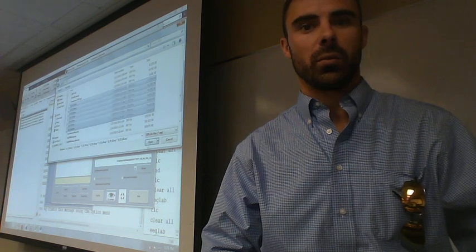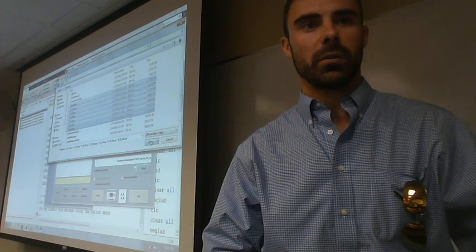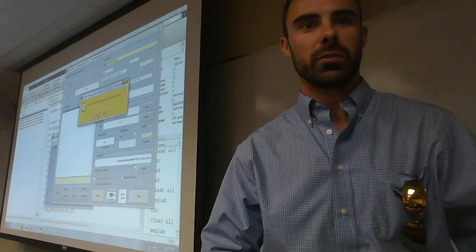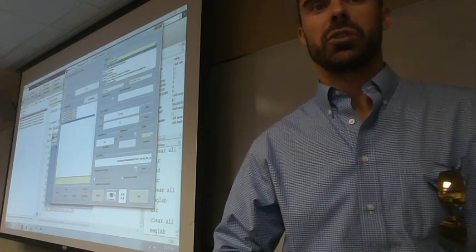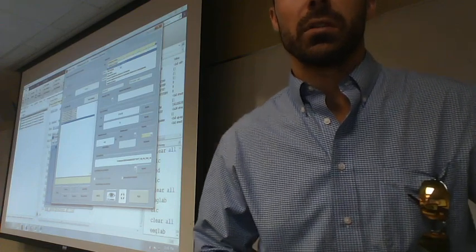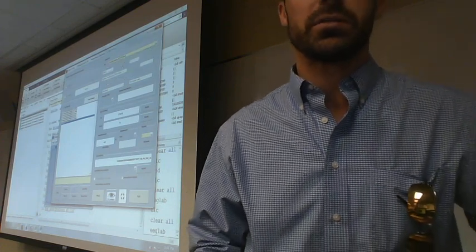And what we will do is say open there. Okay. Would you like to change your current directory? No. Okay. So what we'll do is just do our normal measurements. In this case, our average amplitude between two latencies.